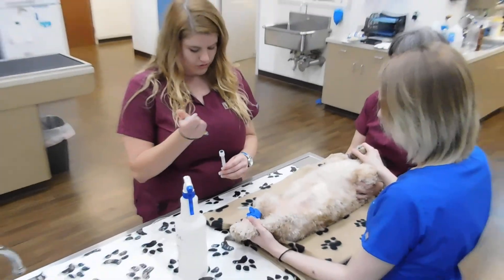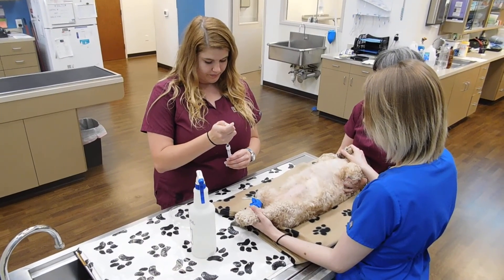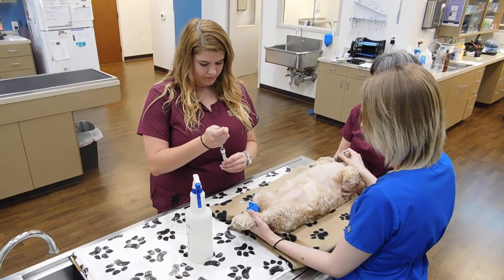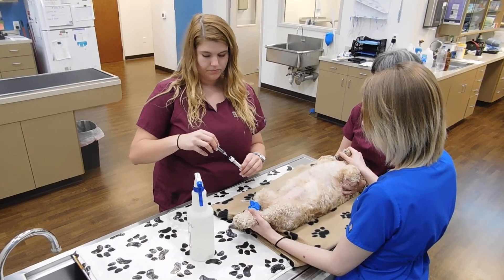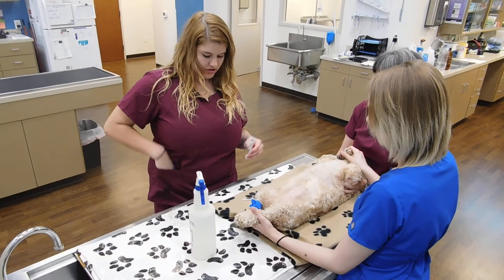Put the sample in my tube. And then I'm going to go ahead and label this with the patient's name and date.